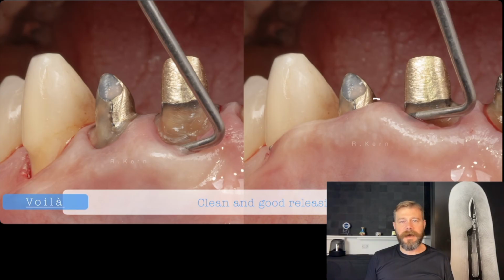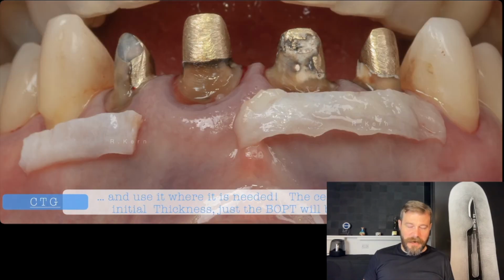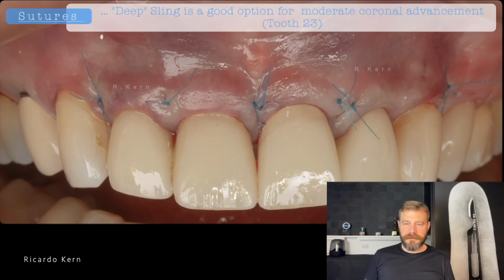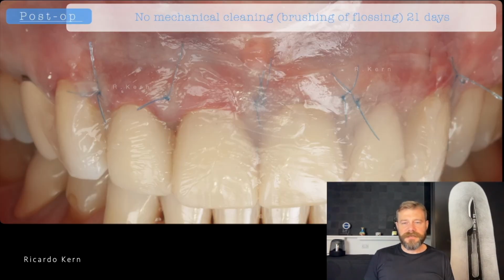Okay, if you have a very good hand and the skills, you need these instruments to tune or to deliver the job. Okay, so that is the idea, just to show the final part of the clinical case. This is our connective tissue graft. We're going to use the connective tissue graft where it's needed and place the sutures there. Over that, a Blue M gel for the post-op care of the patient. You apply that 4 or 5 times a day.